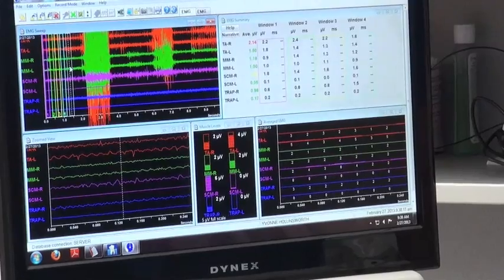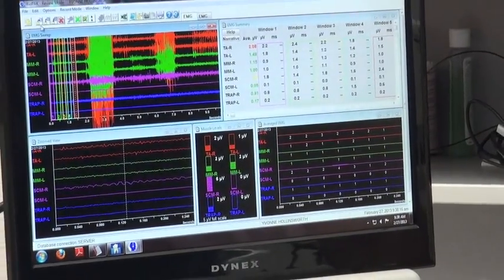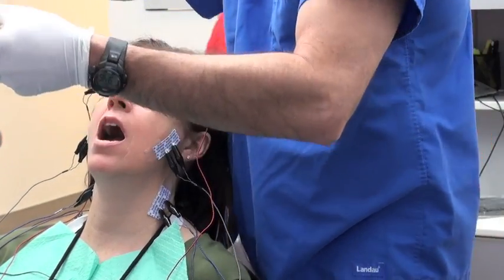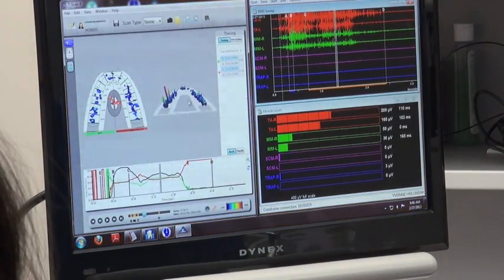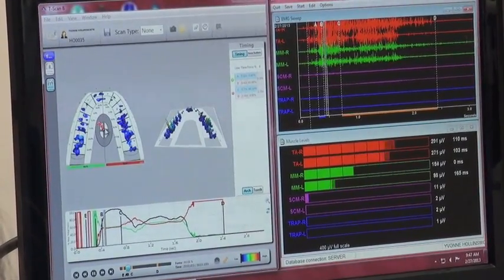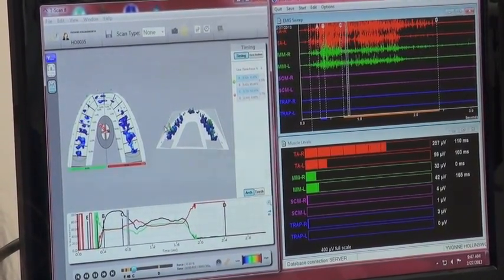Your right temporalis is definitely high for some reason. That's not terrible. Now really hard — one, two, now go to the right and open. Okay, see, it's easy. Your problem's not that big a deal. If you look at this side, the bite side — watch. You're starting to bite down. You've got this big little spike on that left side where it's hurting you.